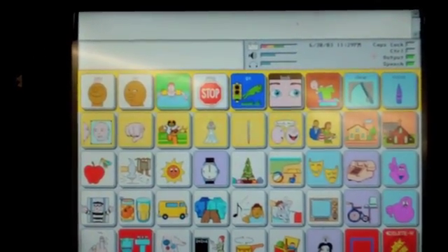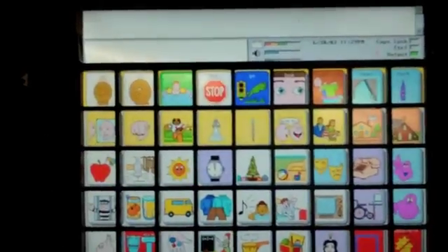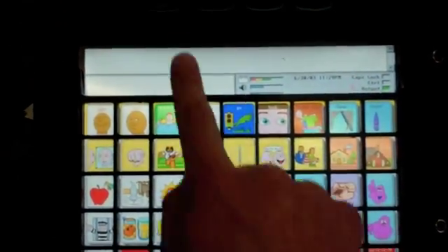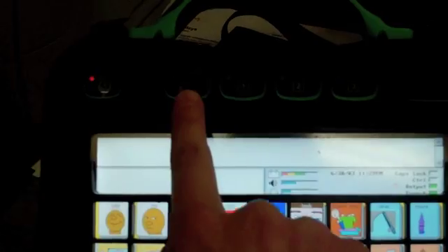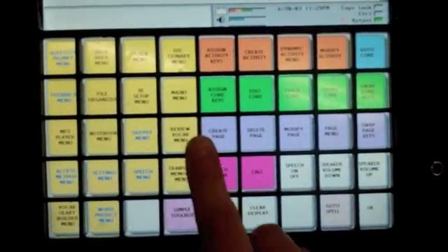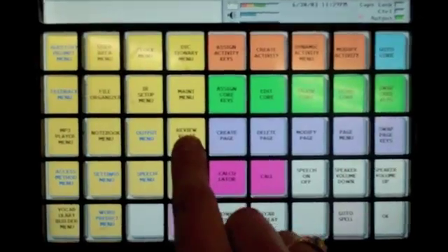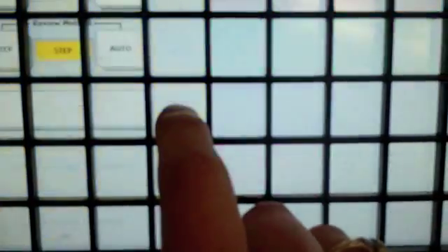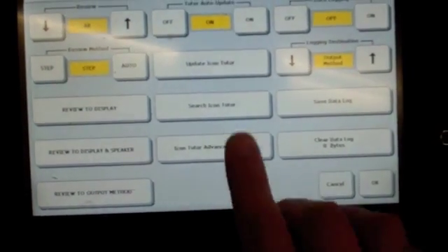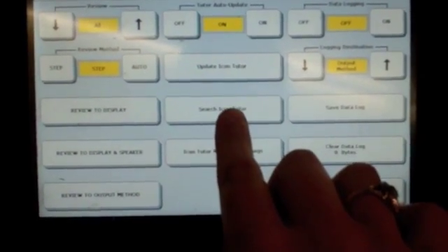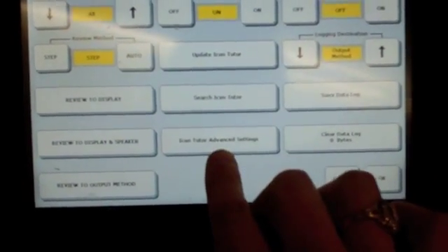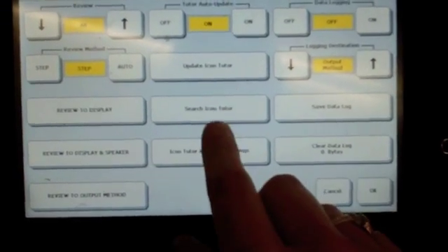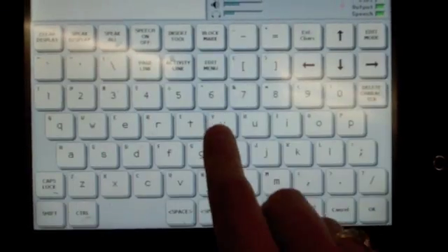The other way in which you can do that is by going through the settings. So if you go up here, if it's not locked, and then from there you go review vocabulary menu. There's update icon tutor, search icon tutor, or icon tutor advanced setting. I'm going to go ahead and go to search icon tutor.